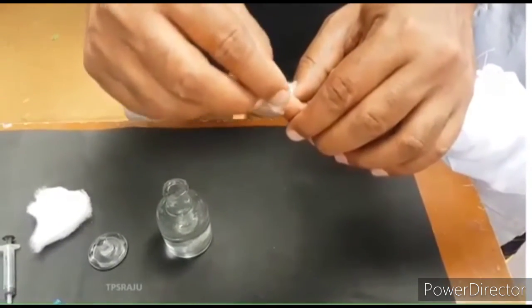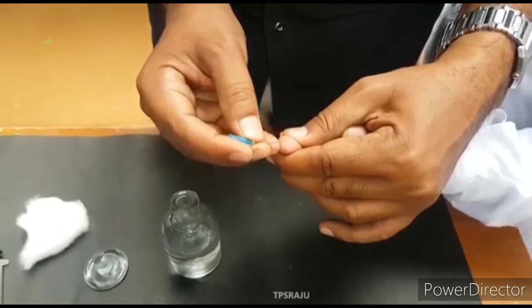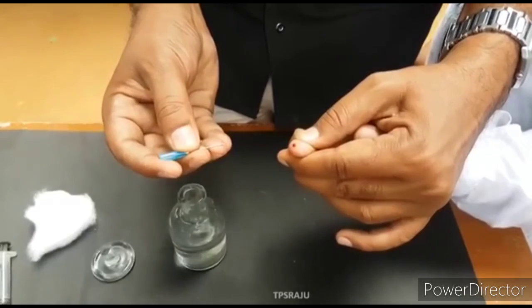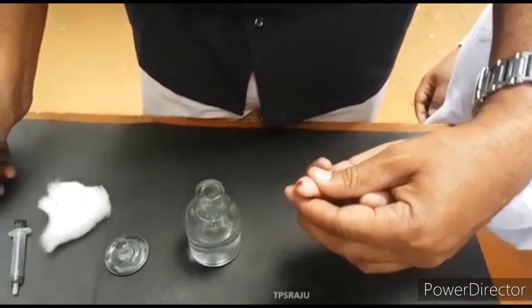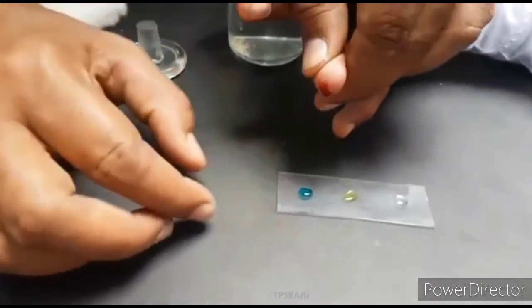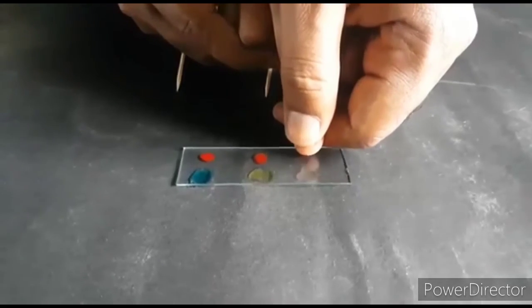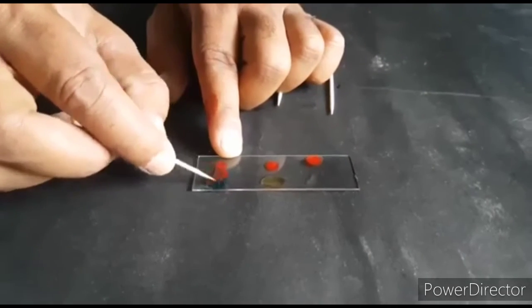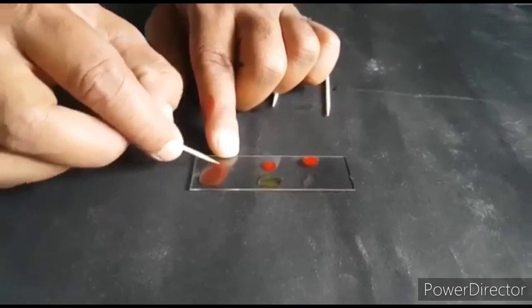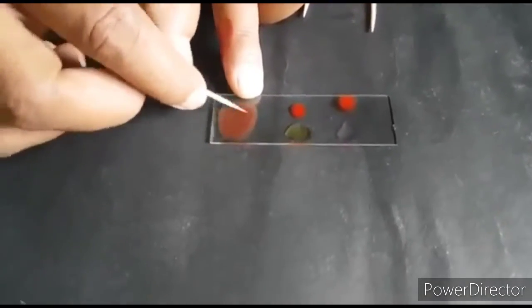Take one surgical needle and prick the finger. Take the blood and inoculate blood drops into the respective drops of anti-D, anti-B and anti-A. Mix the blood with the anti-A. If it agglutinates, then it is confirmed that the sample blood is group A.